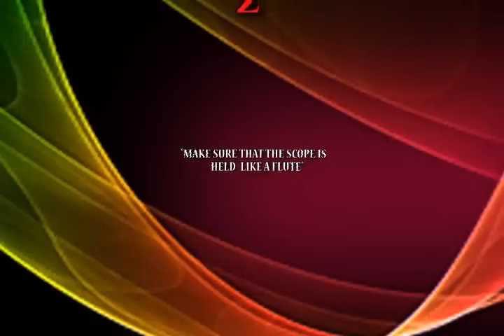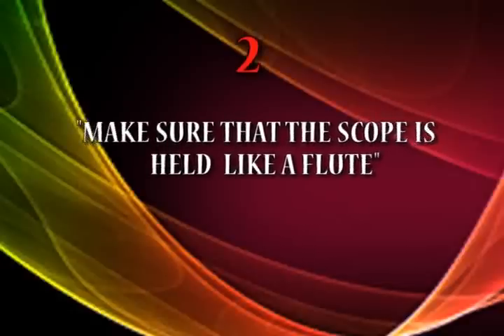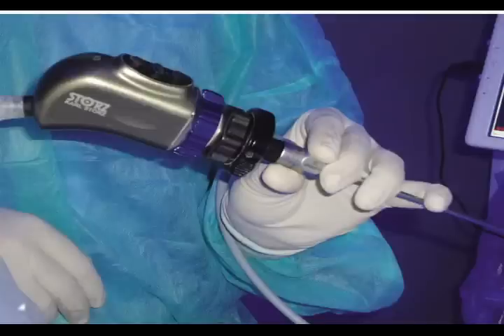Checklist number two: make sure the scope is held like a flute. This is extremely important. Do not hold the camera, because you will have a camera tilt. Your scope should be held with the thumb as a fulcrum.